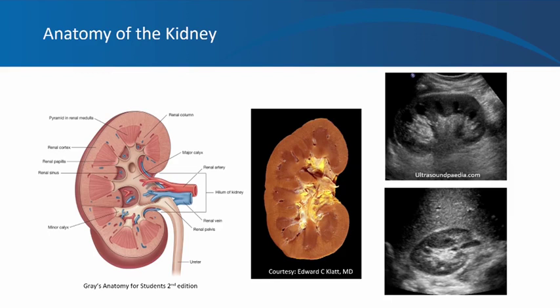Each kidney consists of an outer cortex and inner medulla organized into pyramids. Extensions of the renal cortex project in between the renal pyramids — these are called columns of Bertin, and they are completely normal. It's important to know they exist because sometimes they can become hypertrophied and mimic a mass, so you need to know what is normal to distinguish from a renal mass.